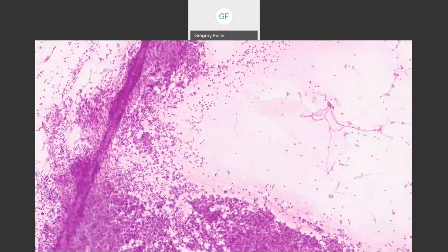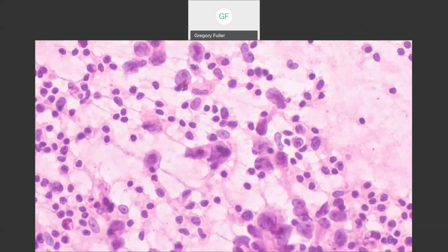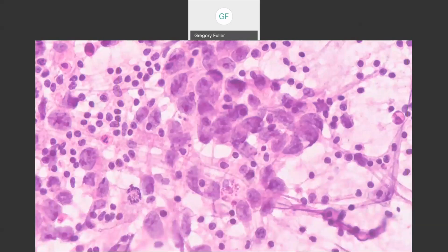I wanted to show more smears. Let's start with the smear, shall we? Here's low power. This is a very high quality smear. Dr. Cathcart's going to stay with germinoma. Look at the high power. Is this characteristic of germinoma? Oh yeah, absolutely. We're seeing two populations of cells, not a continuum, not a Gaussian distribution: a small population of reactive T cells, reactive lymphocytes, and a very large population of the neoplastic germinoma cells with the prominent chromocenters, very ugly looking chromatin.